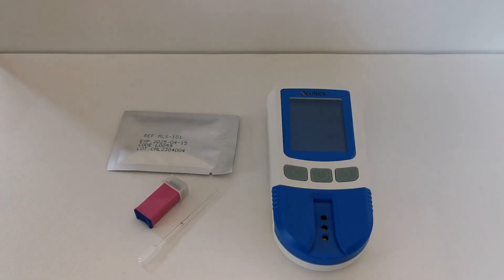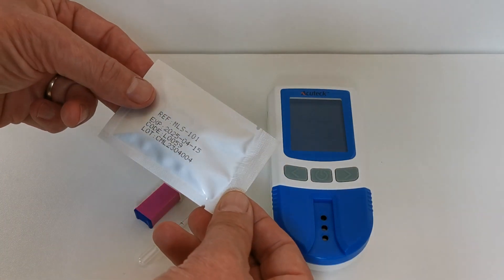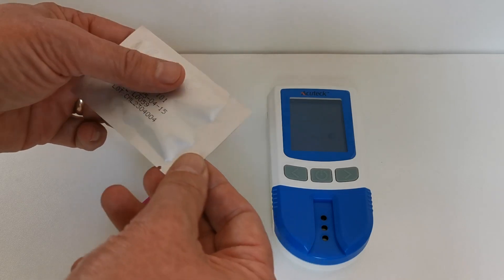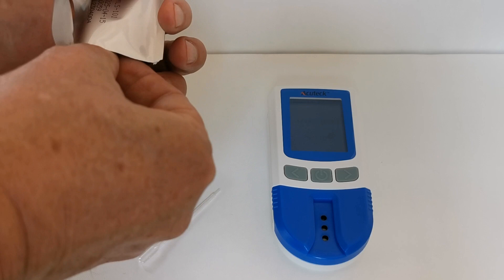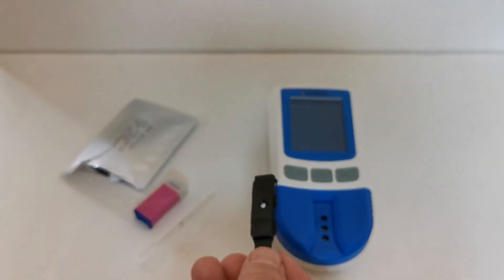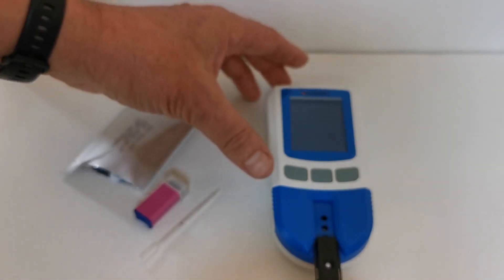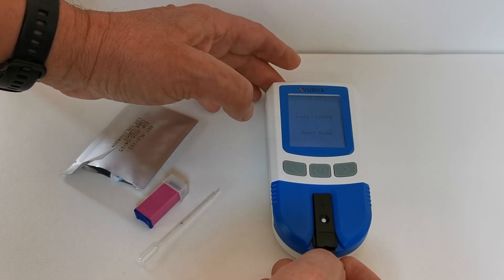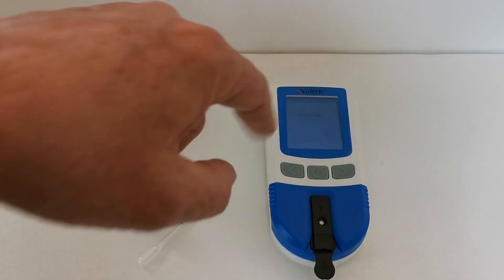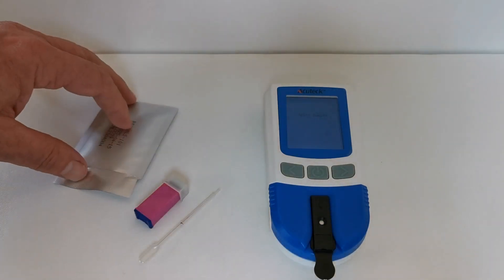We're now going to demonstrate how to perform a cholesterol test using one of the cholesterol test devices. These are individually foil-wrapped and should not be removed from their foil until just before you're ready to perform the test. They have a front and a back section — the back section has three windows and the front section has one. Using the handle, insert the test strip until the monitor recognizes it and asks you to apply the sample.